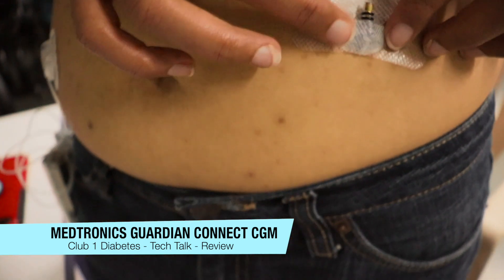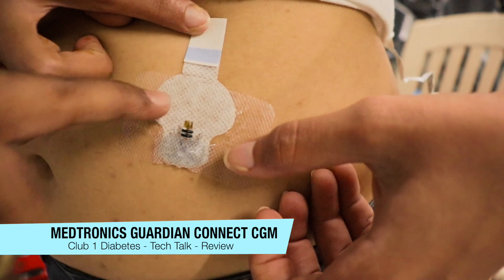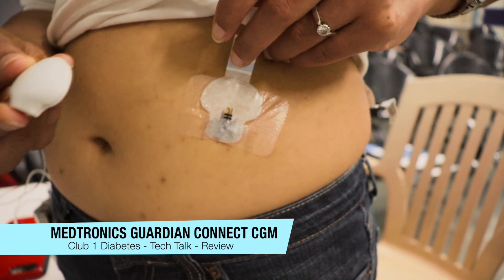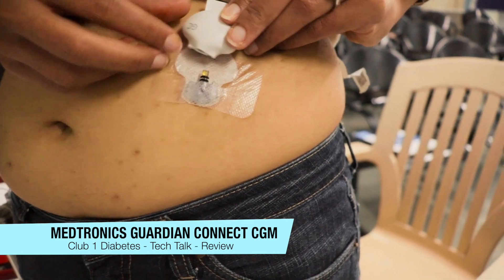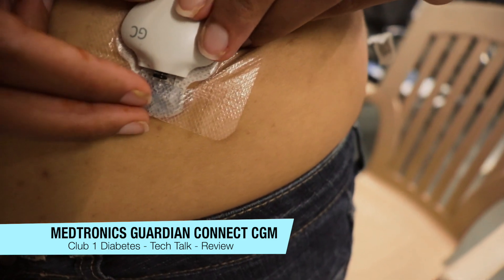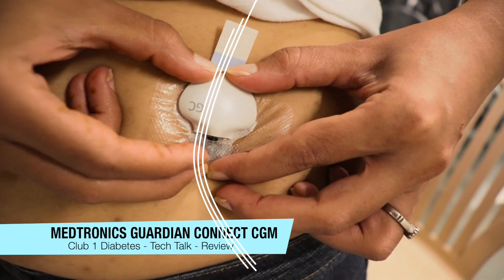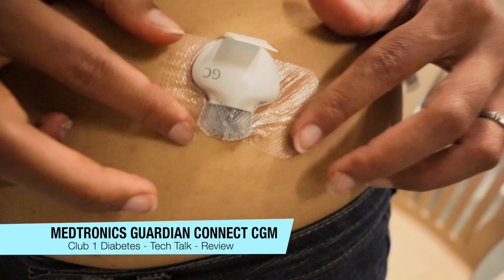You've got to make sure that your sensor and transmitter are firmly taped onto your skin. The CGM needs to be calibrated a minimum of 2 times a day. This shell-shaped device that you see in my hand is the transmitter, which is reusable. It needs to be clipped onto the sensor like this. Once you hear a little click as it goes in, you've got to wait for the green light that blinks.